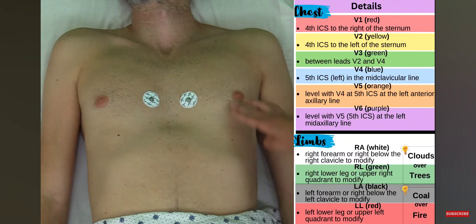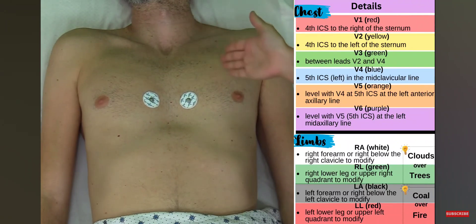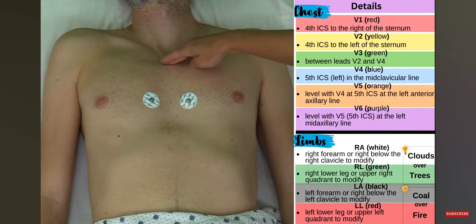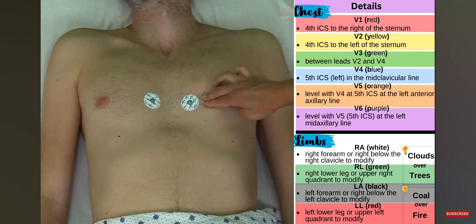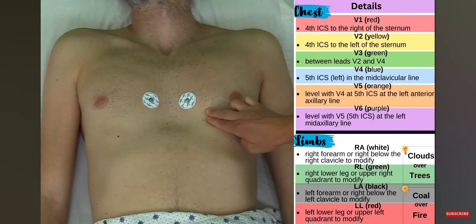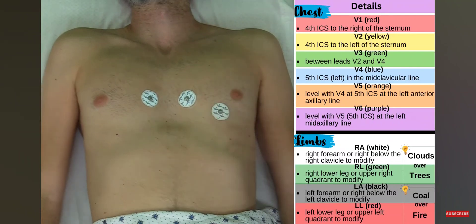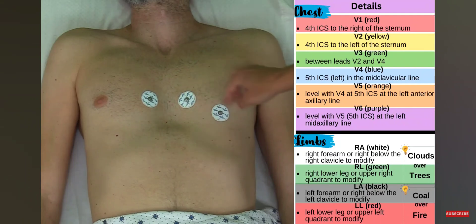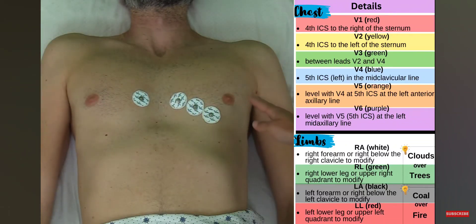Now I'm going to place V4, temporarily skipping V3 because V3 will go between V2 and V4. V4 is at the fifth intercostal space along the mid-clavicular line. Find your clavicle — the beginning and end of it — and cut it down the middle. I repeat the same steps to find the fifth intercostal space and go mid-clavicular, placing V4 right here. Now I place V3 at the midpoint between V2 and V4.